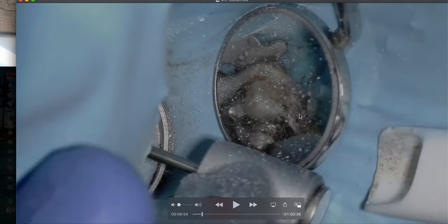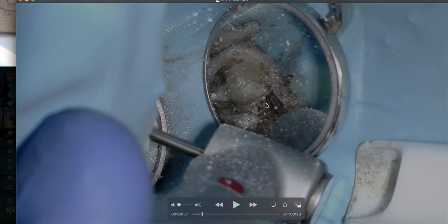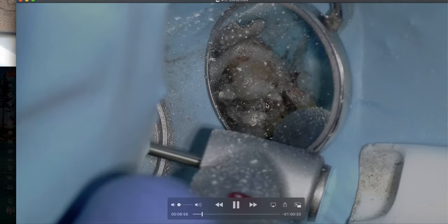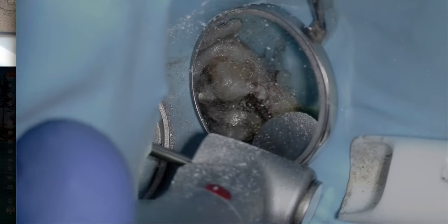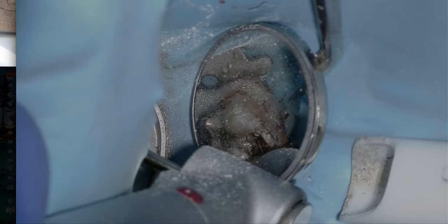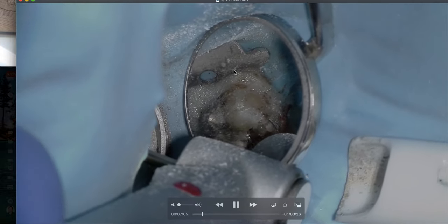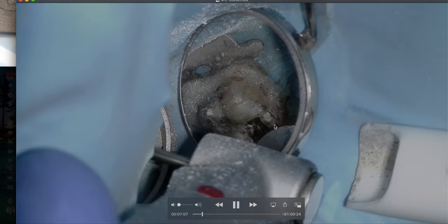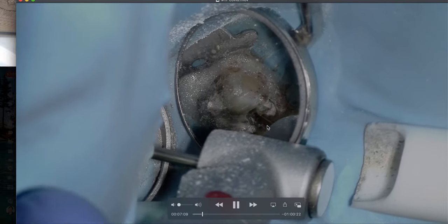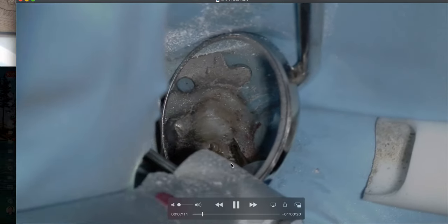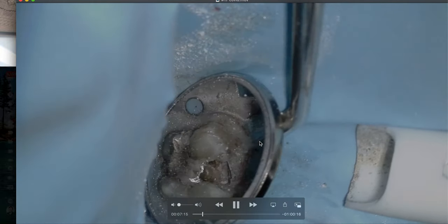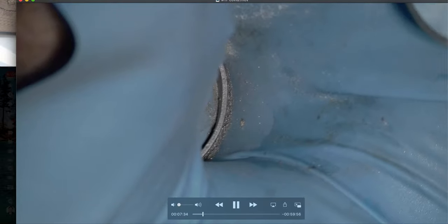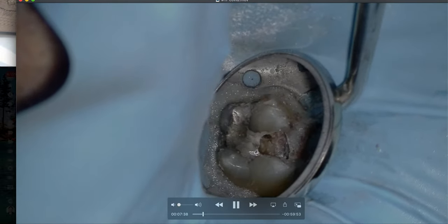Ideally what I should have done is re-rinse with hypochlorite again before I went in. So at this point I should have, and I'll do that next time, re-apply hypochlorite. So you can see we don't have any air-water syringes. We can't use it because that potentially generates an aerosol. So that's why we're getting all that dust on here.